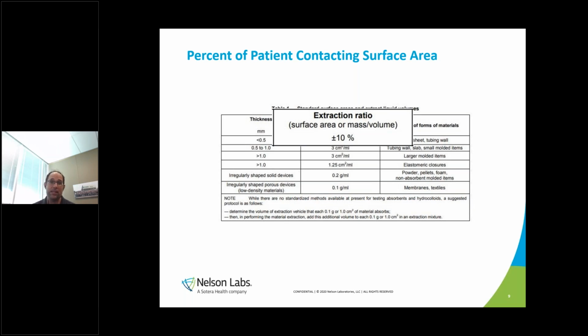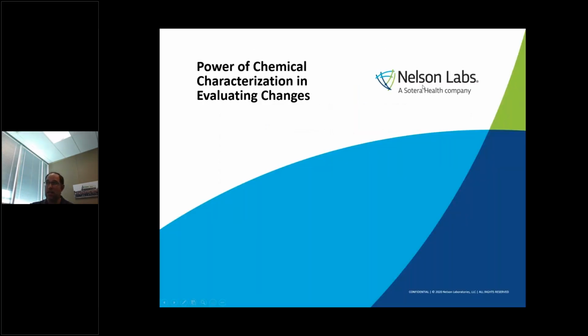If it's less than 10%, then that means that your biocompatibility is probably not going to be as impacted. And so even retesting probably is not going to give you different results. Like I said, there are some exceptions to that, right? So that's just something to consider using a standard. Like I said, this is still in the standard right now, this table 1. It's a little bit different from that one, but it's still in there, the plus or minus 10%.